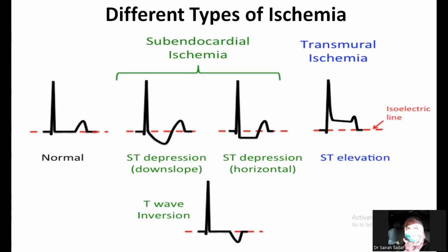Just a brief know-how about that. This is the normal ECG, as we have already discussed yesterday, that we compare the ST segment with which segment for the baseline? PR segment. When we have to comment that the ST segment is elevated or depressed, we compare it with the baseline. And which was the baseline? Baseline is the PR segment, which is not visible here.